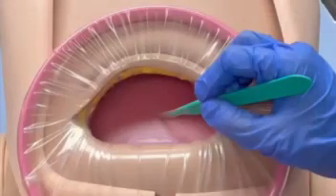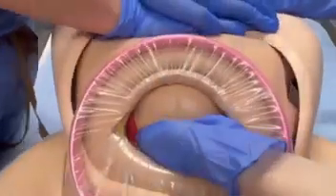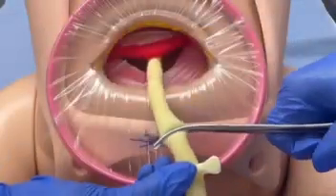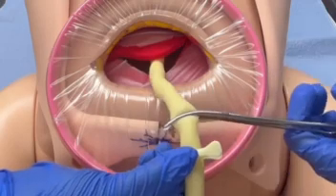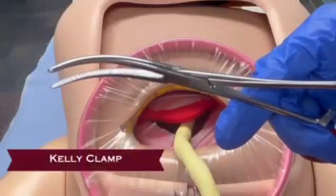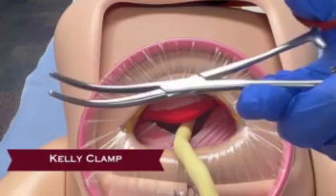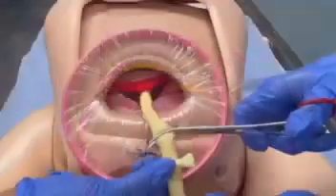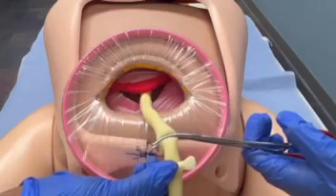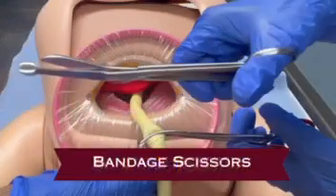The hysterotomy is then created through the lower uterine segment using a scalpel. After delivery of the baby, the umbilical cord is clamped using a hemostat or a Kelly clamp. Kelly clamps have a coarse, horizontal grip similar to hemostats, but are larger in size, making them ideal for securely holding substantial amounts of tissue or vessels. The dense umbilical cord is then cut with curved Mayo scissors or bandage scissors.